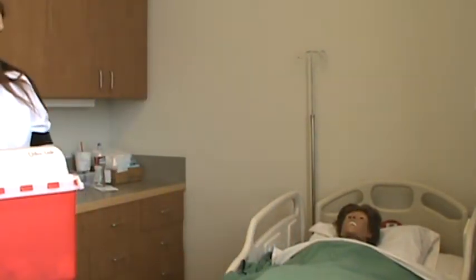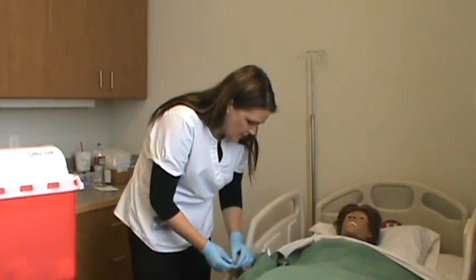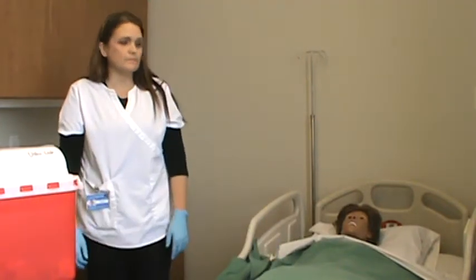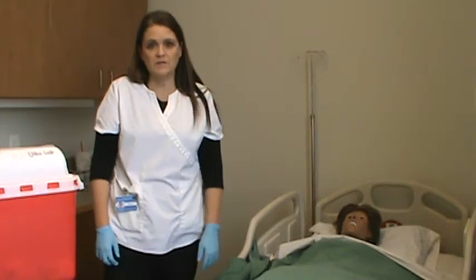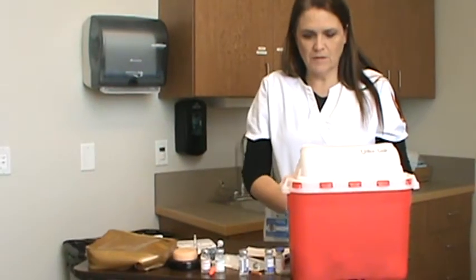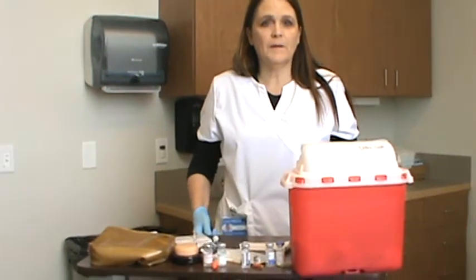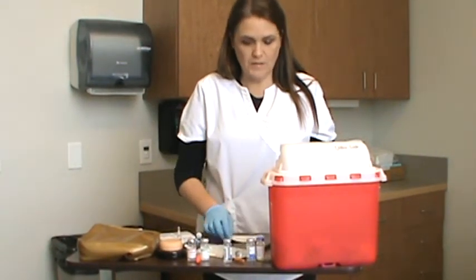Again, I would also, while I'm here, check her blood glucose to make sure that it is in line with receiving insulin, because you would not want to give her the insulin if her blood glucose wasn't within the right range for that. And I would also make sure with the insulin that her tray is ready to be brought right to her.